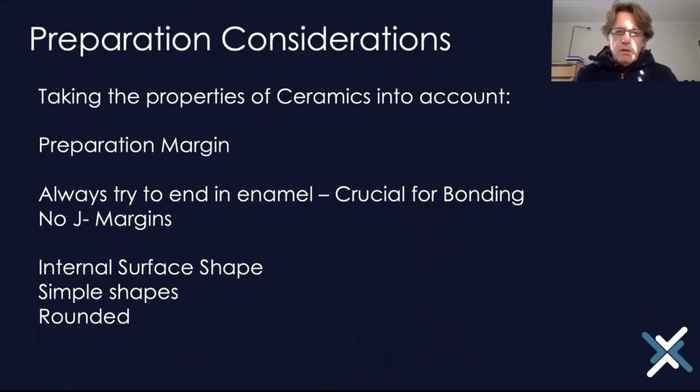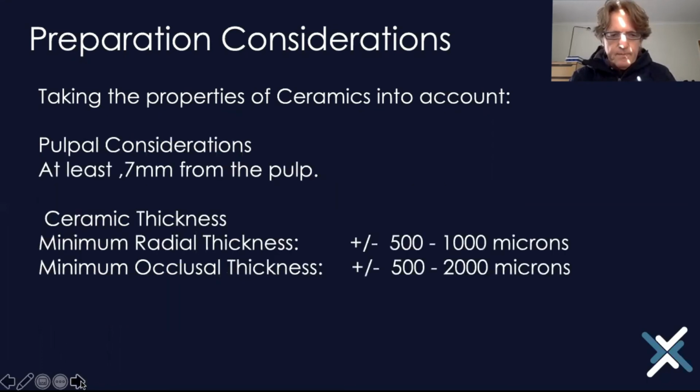It only meant that you cannot prepare those super sharp angles. So in the case where you're going to work with a scanner, 99.95% you are going to prepare something which is going to be restored with a glass material, and therefore you need to use soft, rounded shapes on the internal surface, as smooth as possible, and all the transition areas as soft as possible.